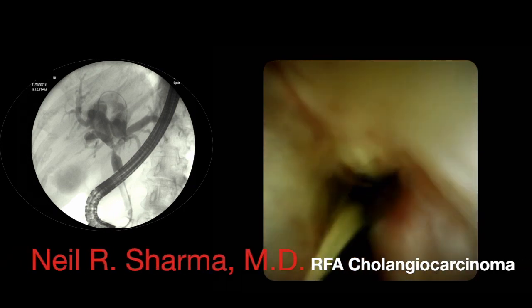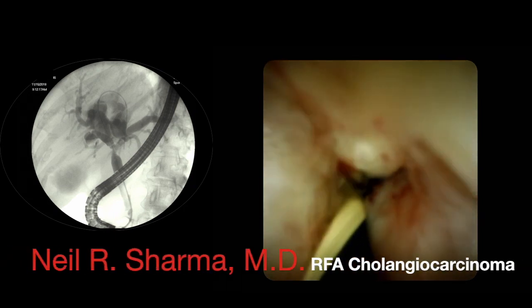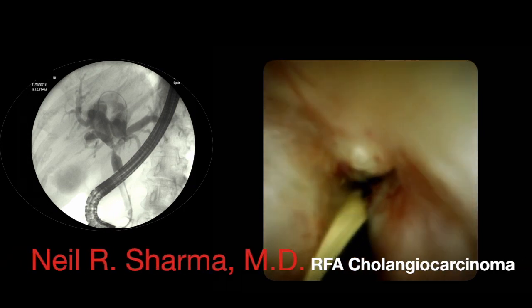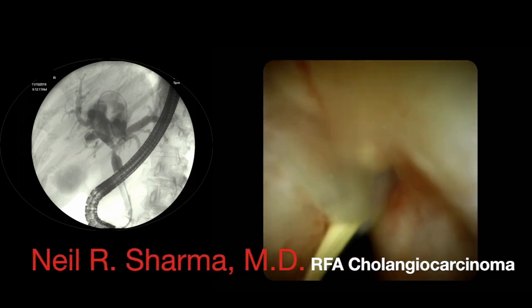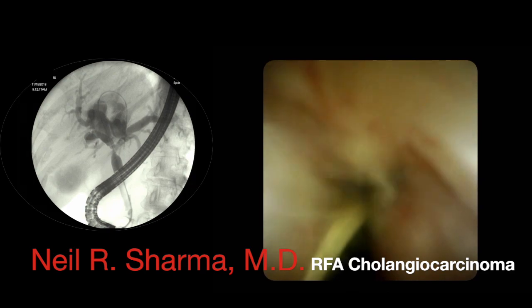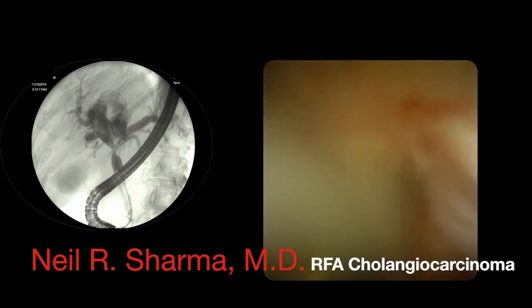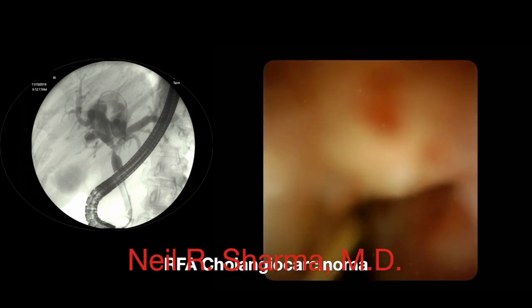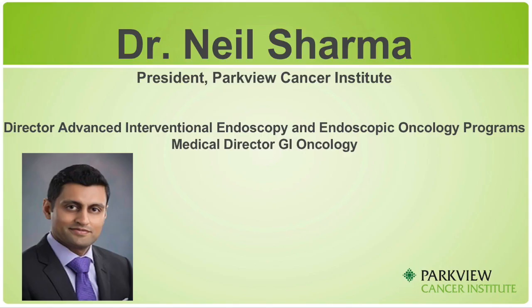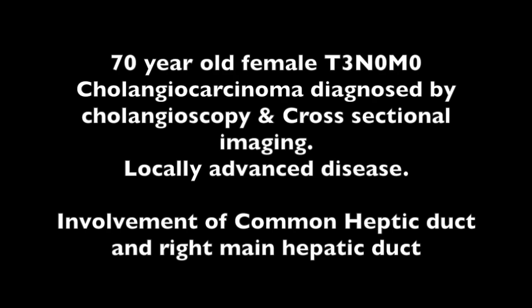In this video, we will demonstrate a case of radiofrequency ablation for the treatment of cholangiocarcinoma. We see a wide variety of applications for radiofrequency ablation, including the intraductal treatment of cholangiocarcinoma.